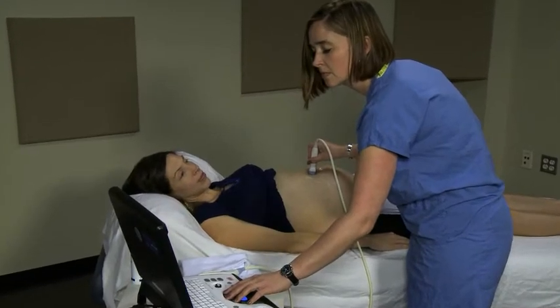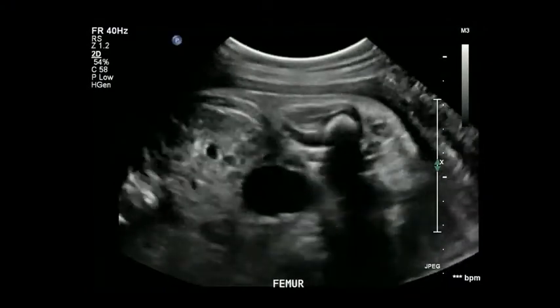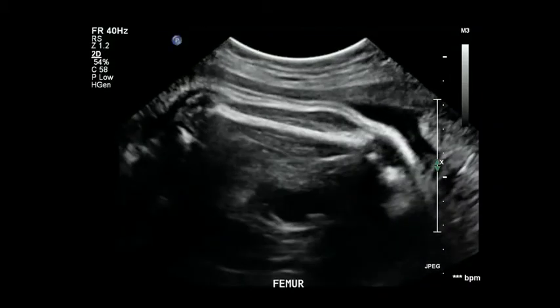Finally, the femur is measured. Make sure you have the correct bone before you freeze and store your image — the humerus, the upper arm bone, looks just like the femur. Once you know you are looking at the femur, try to orient the femur perpendicular to the transducer. Place the calipers on the outside of the bone to measure the entire length. Don't worry if this is confusing — you will have practice opportunities during the live training sessions.